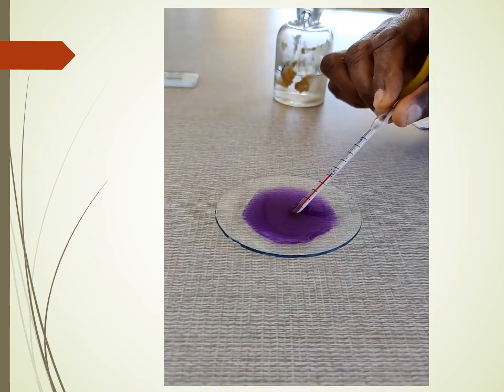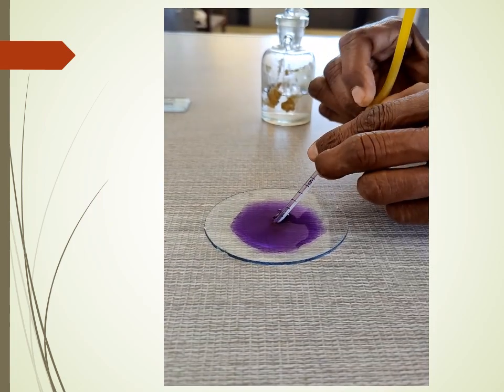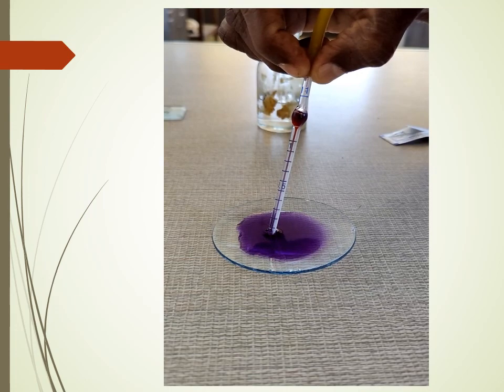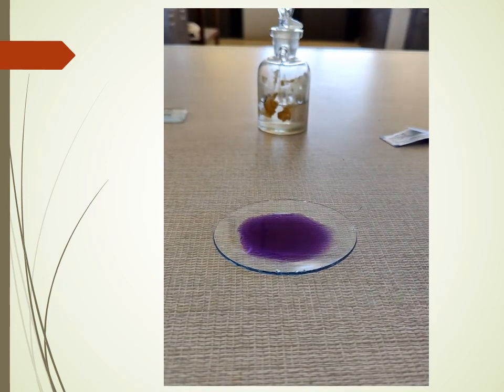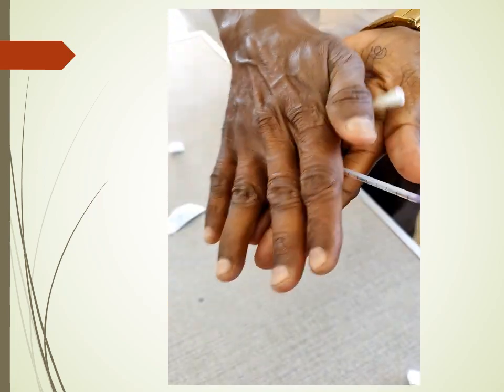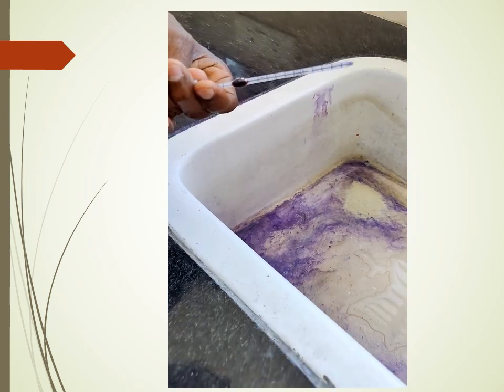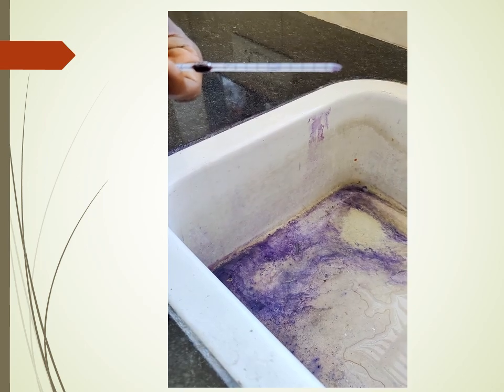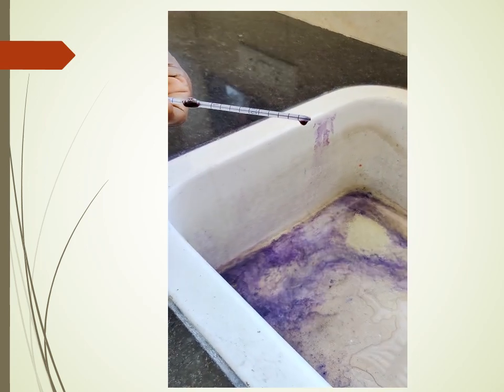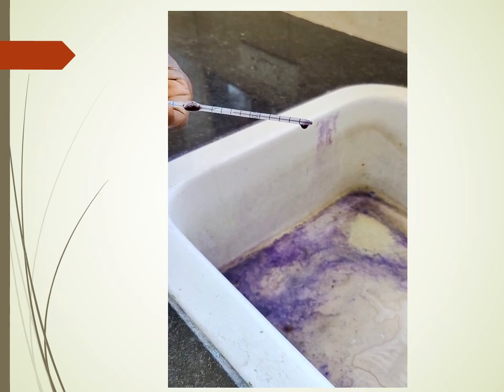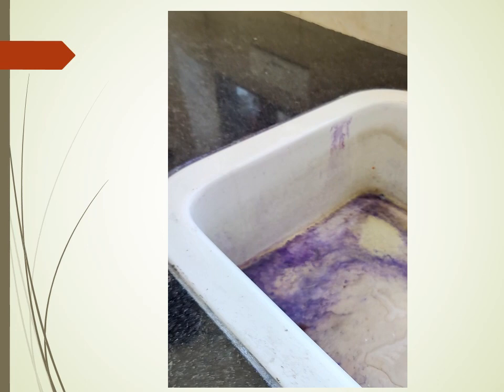Wipe out the pipette tip, then dilute the blood by sucking the WBC diluting fluid up to the 11 mark. Mix by rotating the pipette horizontally between the palms. Then discard the first 2 to 3 drops from the pipette, holding it in an inclined position.